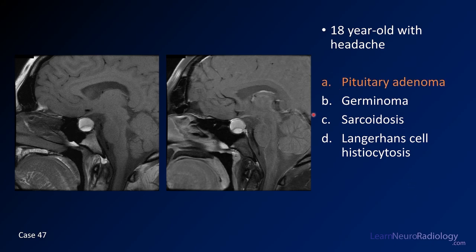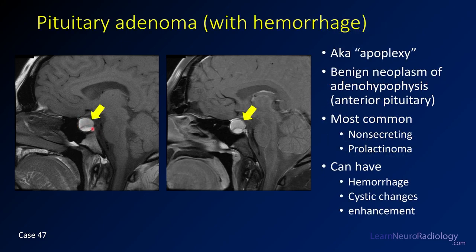This is a case of pituitary adenoma. On pre-contrast imaging you've got a T1 hyperintense, somewhat heterogeneous mass with septations. There's a thin rim of enhancement on post-contrast, and it is replacing the pituitary with expansion of the sella. This is a pituitary adenoma with hemorrhage — pituitary apoplexy. Most commonly these are non-secreting or prolactinoma. They're frequently heterogeneous with cystic changes, and the T1 hyperintensity here is likely from hemorrhage.